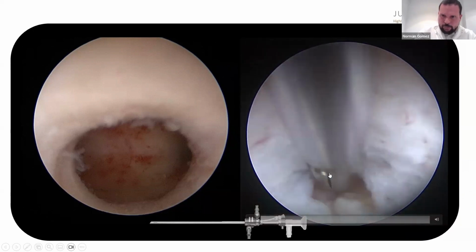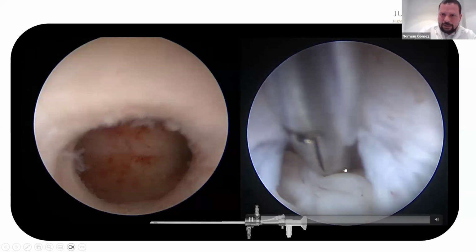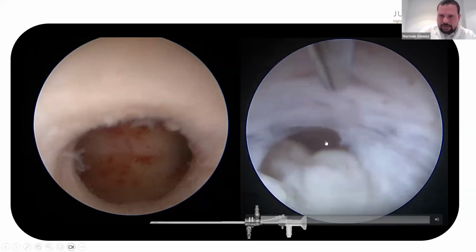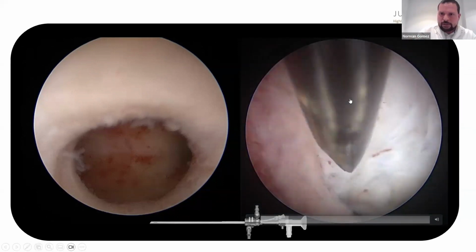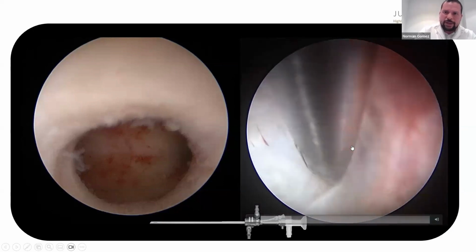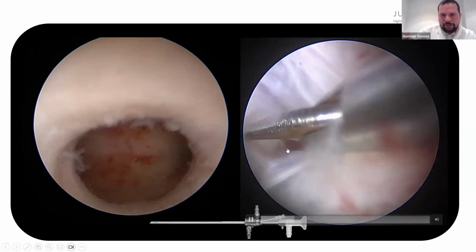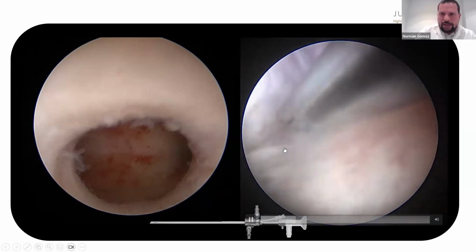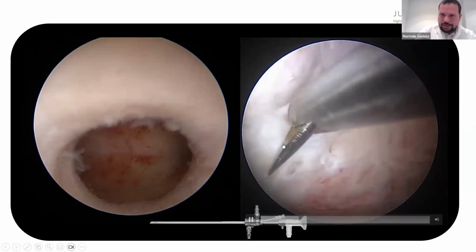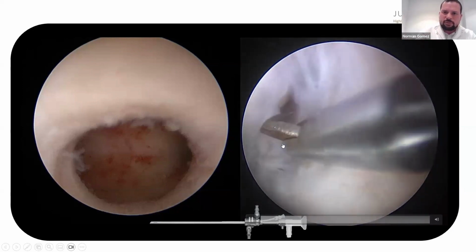You can approach, and with the scissors you open the jaw in the correct plane, and the liquid does its job, entering inside the pseudocapsular plane and dissecting some part of the pseudocapsule. So that's how you can visualize the planes very well. Now we move to the surrounding area of the myoma, and we repeat the same to know all the limits of the fibroid.